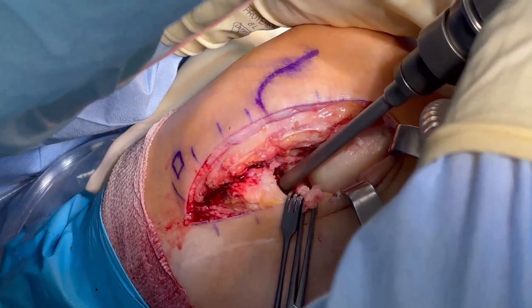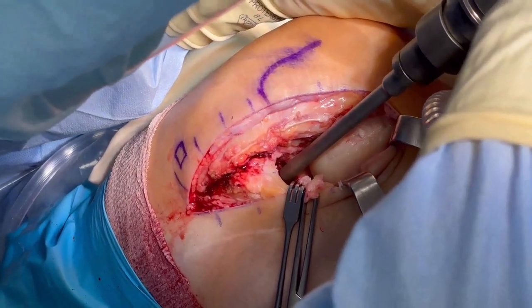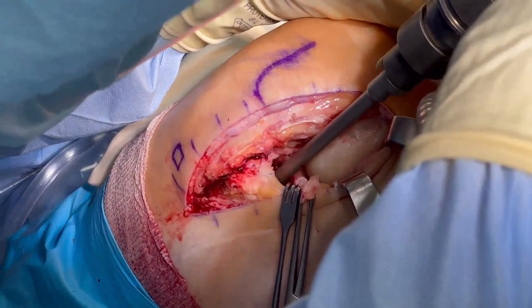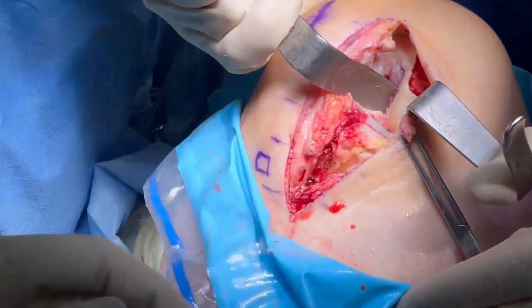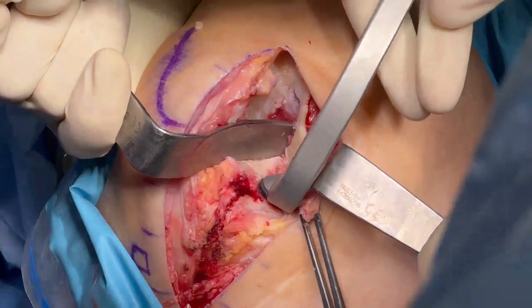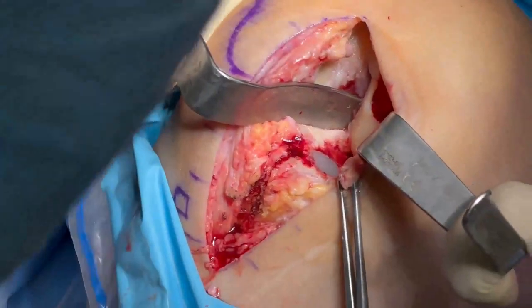Then, the peg drill was inserted into the hole created by the pin and drilled under power until the shoulder on the bit contacted the bone. A pea-sized amount of cement was applied to the central drill hole, and the tibial implant was placed into position and seated with the tibial impactor.